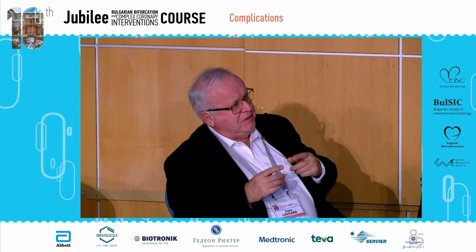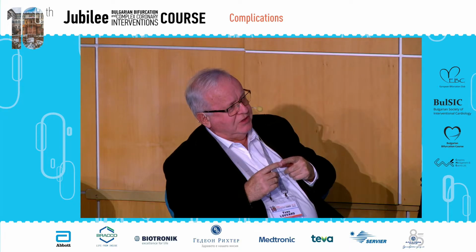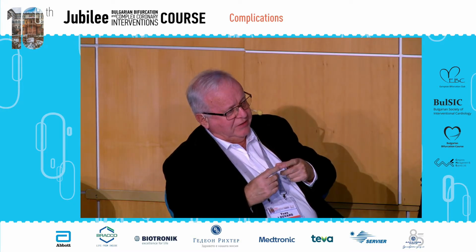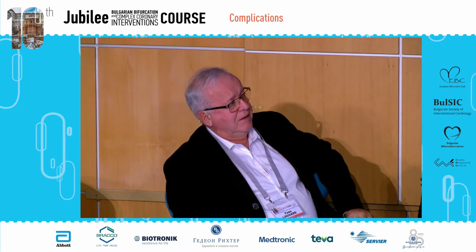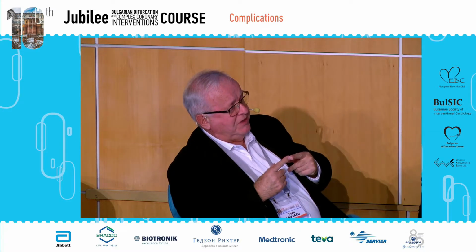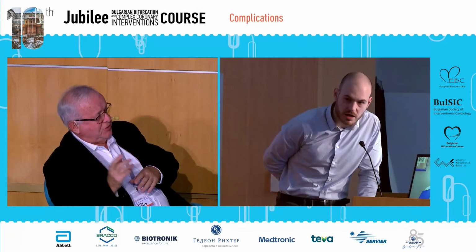Have you attempted to leave the bifurcation unstented? Was it intentional, or were the two stents, the PDA and the distal right, really overlapping? These are the two stents between the distal right and the PDA that were overlapping? Yes. Or did you leave some space for the PDA?